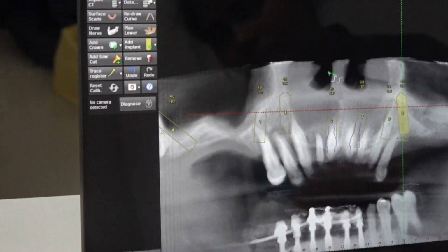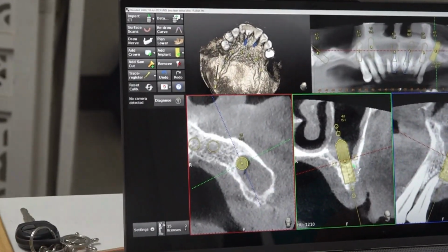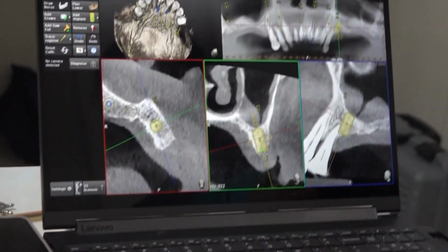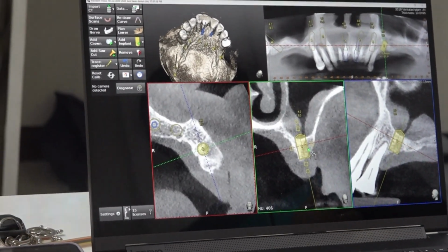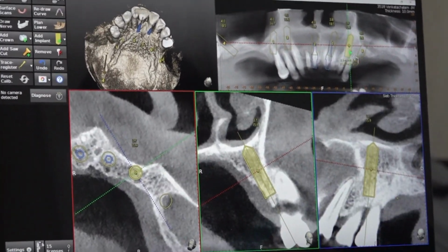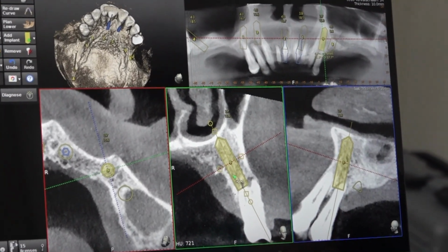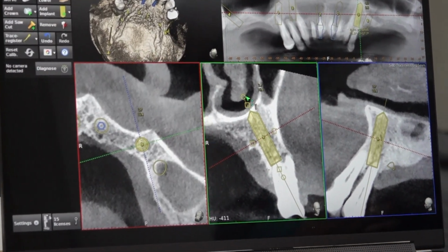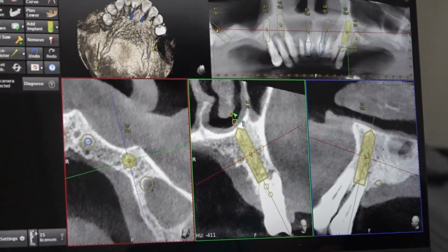So one more option in this scenario we will try. You can put a short implant in the second premolar, say 10 mm. Okay, very short implant. Remove this, and we can place a good implant on the second premolar, straightforward. Okay, so the drawback is that the implant is not in very good bone.